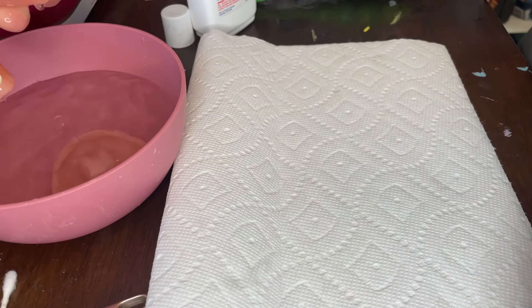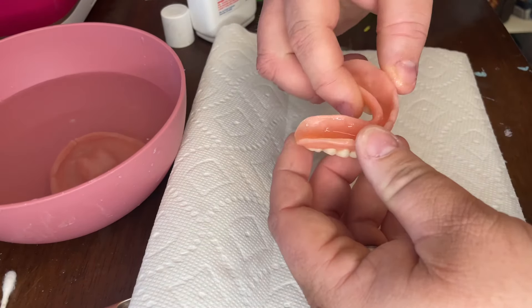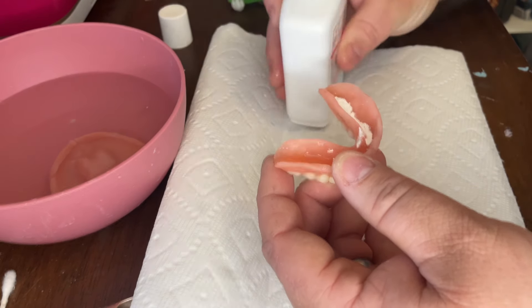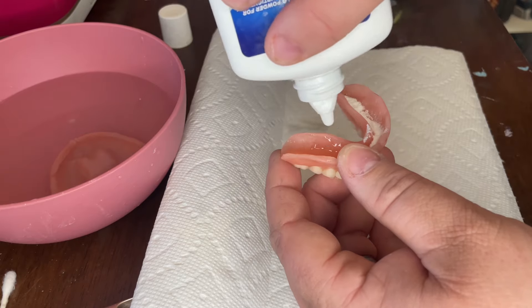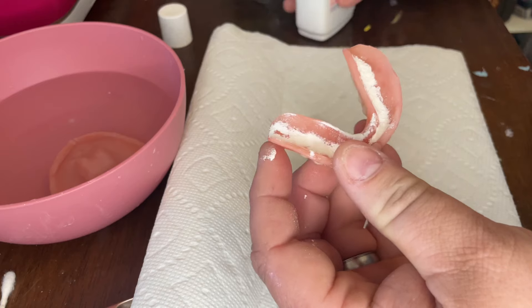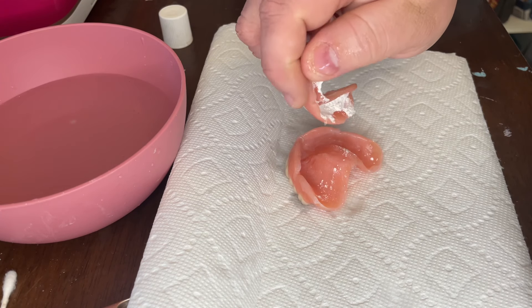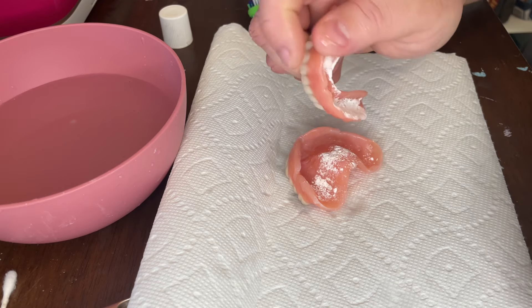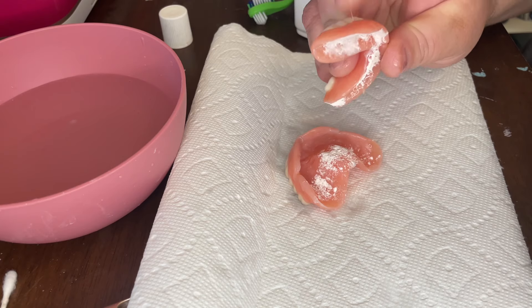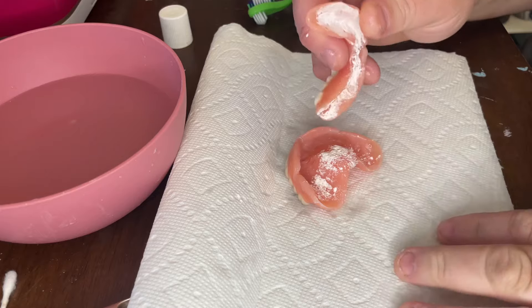Now using the powder adhesive, you want your denture to be wet on the inside of the trough. Grab your denture above a paper towel and pour the powder into the trough, tapping it if it gets stuck. I'll hold one denture over the other and tap on the lower denture to evenly spread out the powder — the excess falls into your other denture so you're not wasting any product. It works out pretty well.